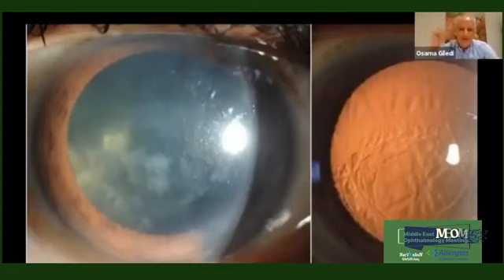I compare. It's very good to compare both eyes because the cornea thickness from person to person can be different. So if it's more than 100 from the other eye, that really is a bit of a dangerous sign. But I don't have a cutoff thickness. I'm not sure. Do you have any?